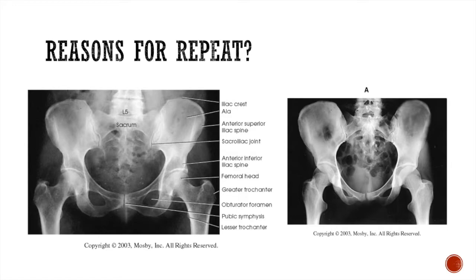The picture on the left demonstrates an incorrect AP pelvis because you can see a good amount of the lesser trochanters and the femoral necks have been foreshortened. This is because the patient did not properly medially rotate their feet and lower leg. The picture on the right demonstrates the correct positioning because you can barely see any of the lesser trochanter and the femoral neck is not foreshortened.